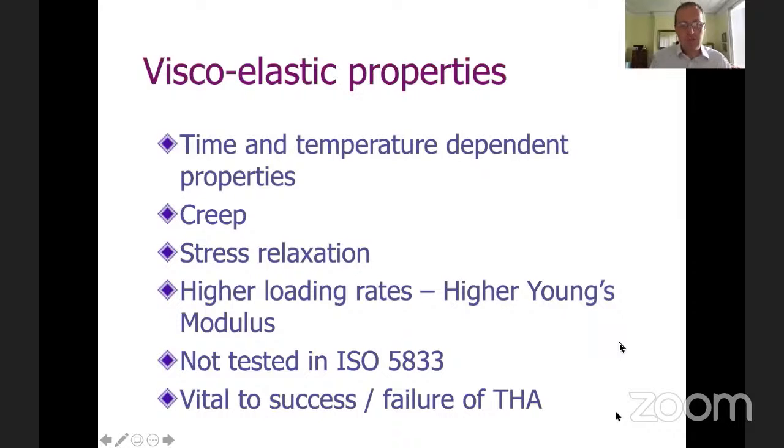But it also is something that you should be aware of when you are doing the surgery. So, for example, that very common thing that we will find is that the cement's going off a bit quicker than you were expecting. Maybe it's a hot day or something, and your stem is only halfway in. So what do you do? Do you hit it to try and get it in? Well, you know that you shouldn't, because cement is a viscoelastic material, and therefore the higher the rate you load it at, the stiffer it becomes. So you don't hit it with a mallet to try and get it to go in. You just keep steady, slow pressure. But if that really doesn't look like it's going to work, get it out and clear everything out and start again rather than trying to hit it.